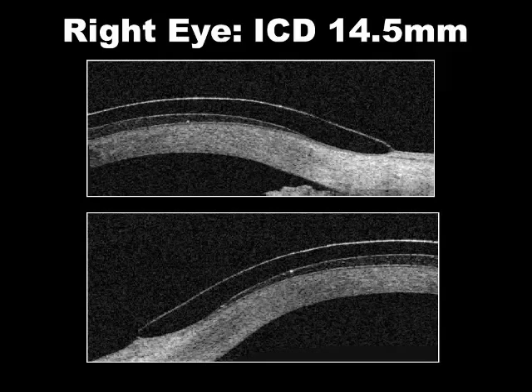Then here's the periphery. Notice how the lens touches itself down just at the limbus. So this lens has just cleared the limbus, placed more of its pressure just beyond. So this lens may just have been big enough to fit this larger cornea. And again, I'm reminded of that consideration that the 14.5 is a smaller diameter lens. It has less space to land itself down. So consider the ICD 14.5 on smaller corneas, not on larger corneas.